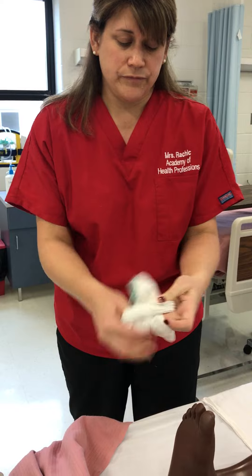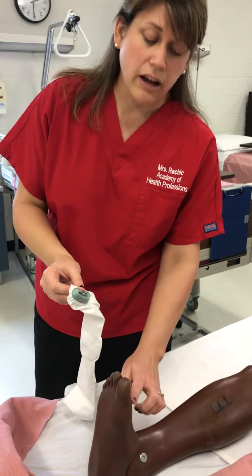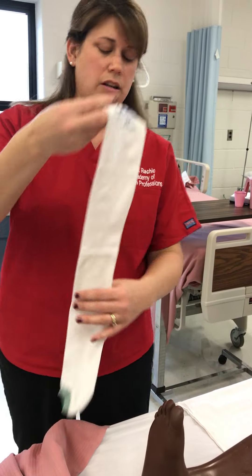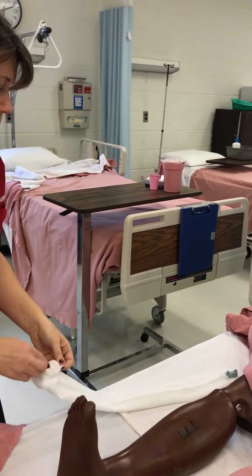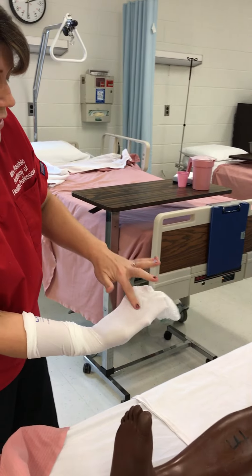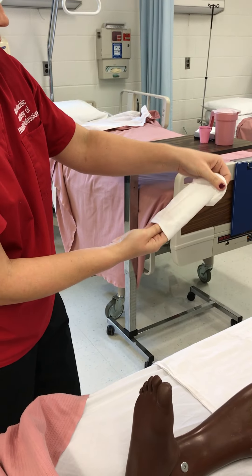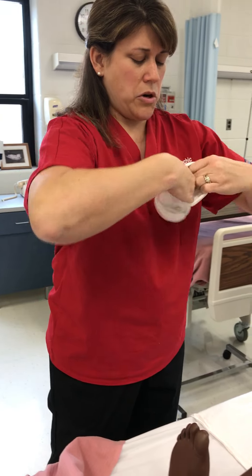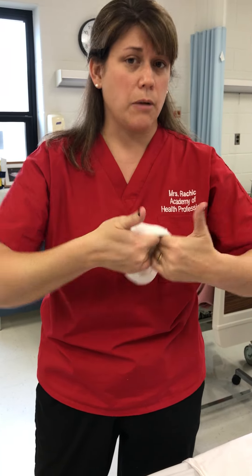The other important thing I should mention is you have to know where the toe is. The toe in TED hose is usually on top of the patient — the opening for the toe is usually right on top. You have to make sure you know when you're putting this on where the toe is: is it on top or is it on the bottom? So here I've got my toe — it's on top facing me. I'm going to flip it over so the toe is facing away from me. Hand in my sock, I've got my heel, I pinch my heel, and pull it all the way down to the pinch. The most important thing is to get your hand all the way down in this sock and spread your fingers as wide as you can before you even start putting this on the patient.